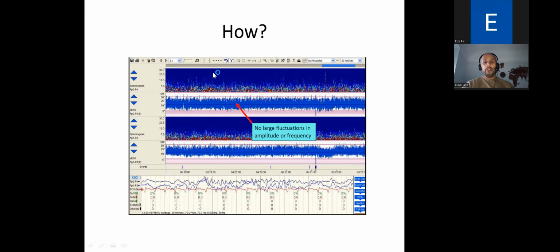Then you look at how fast it's going, and you can see it's going at a steady rate. There are no massive jumps in how fast it's going. So I would classify this as a normal CFAM. And then you can scroll to a particular activity, and you can see these random squiggly lines, rather than any rhythmical activity, which would suggest seizures.